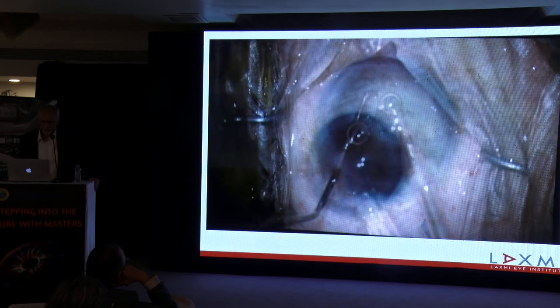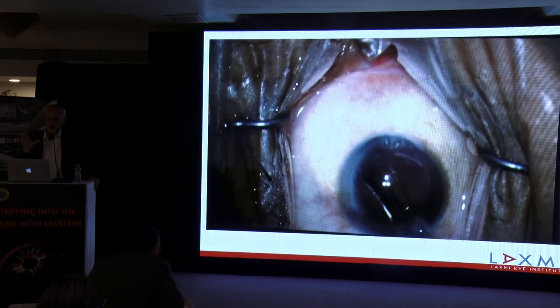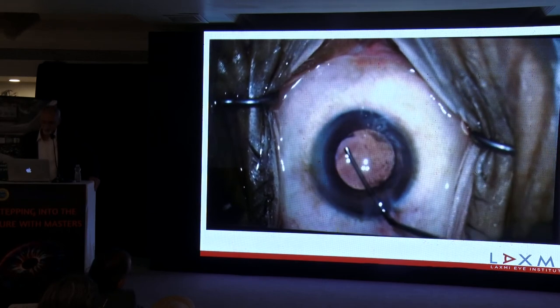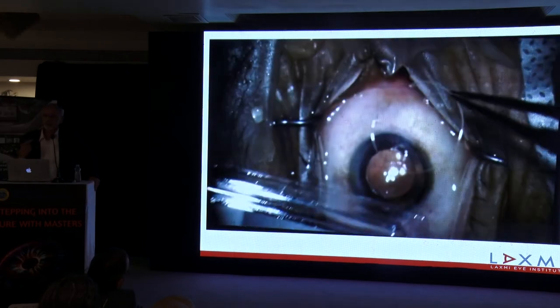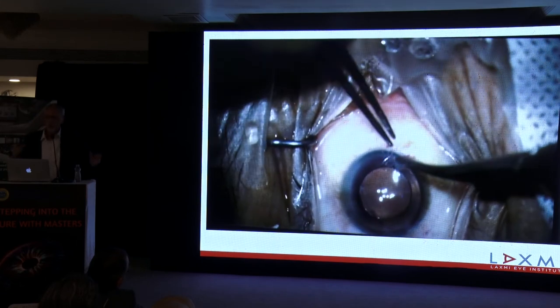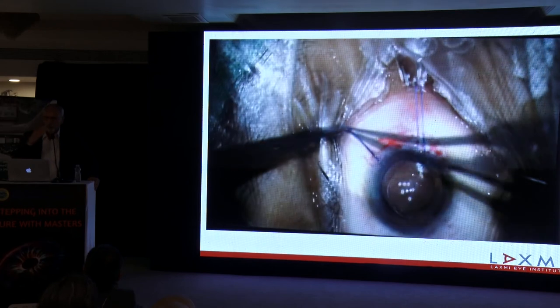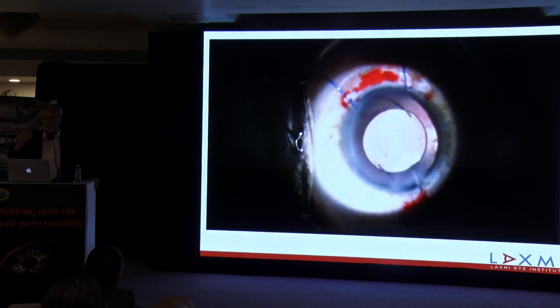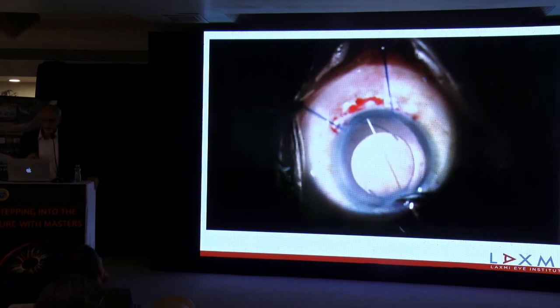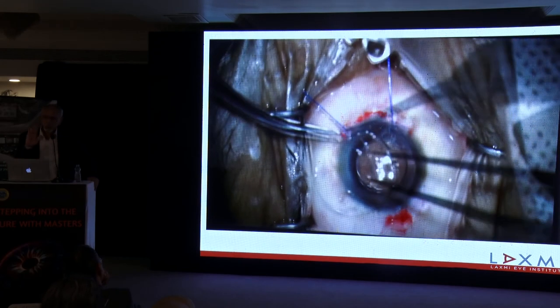Once the cataract was done with, the obvious choice was to use a three-piece lens, with whatever benefit those haptics would give you to push that. After that, I injected pilocarpine to constrict the pupil and used a modified Cionni ring with two eyelets. One eyelet was positioned between 2 o'clock and 7 o'clock, and the second one was positioned exactly opposite. I used the hooks to open up the iris so that when I put my needle, it will straightaway go into the sulcus and out.